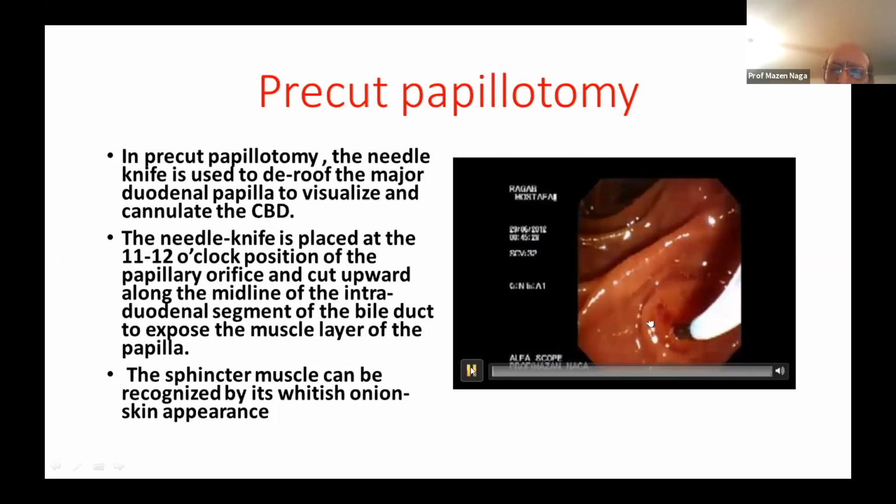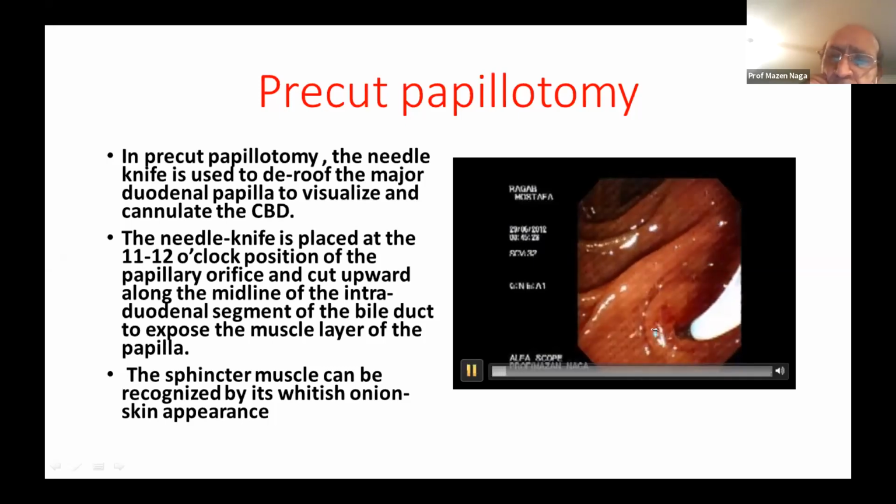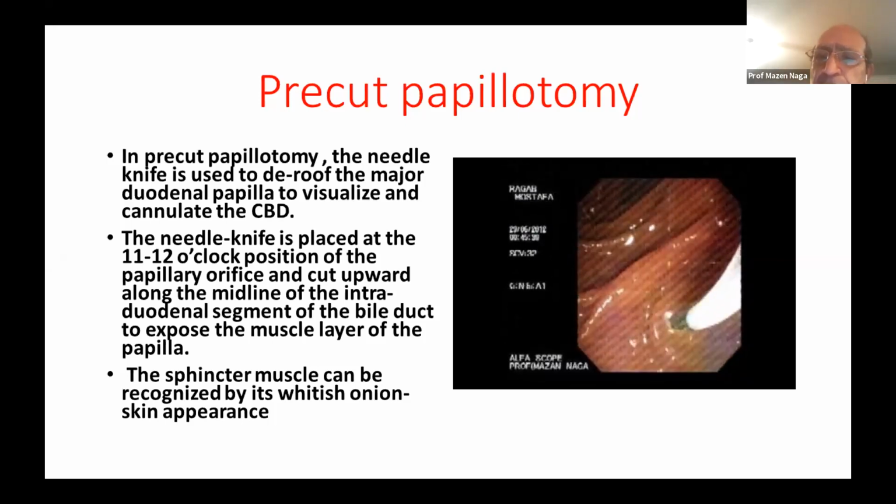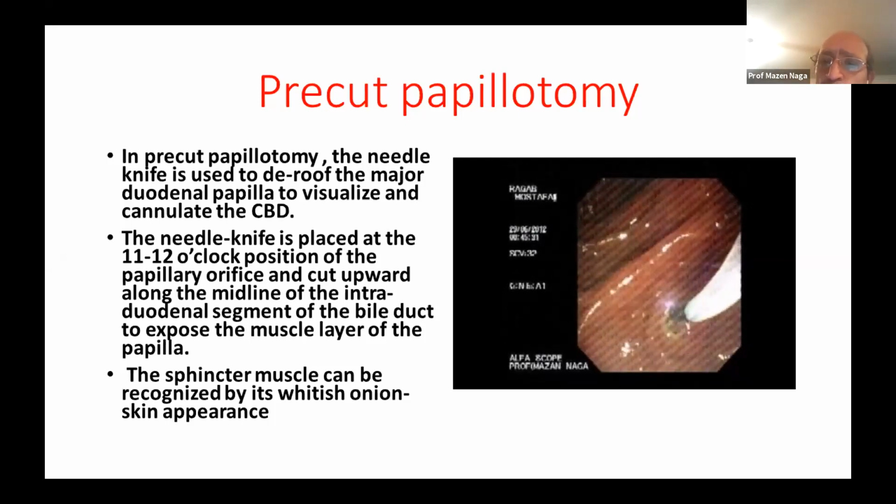We'll see now how we can overcome difficulty in a small papilla. We cut, as in the previous case, first the mucosa to expose the muscle layer.